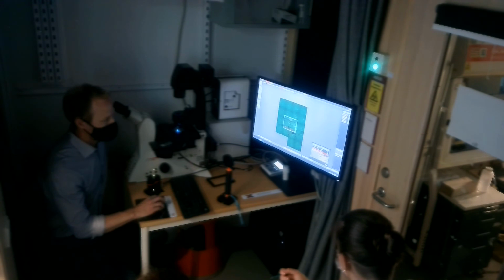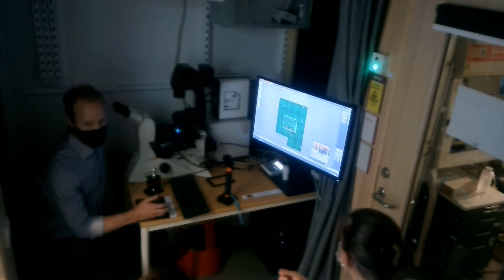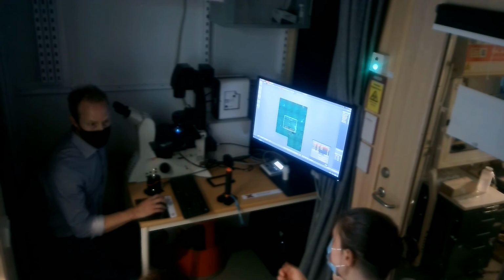So if I wanted to take some images out here, I would probably make the focus map even include these ones. I would probably add one more here, maybe one more here, and so on. So you can do more.